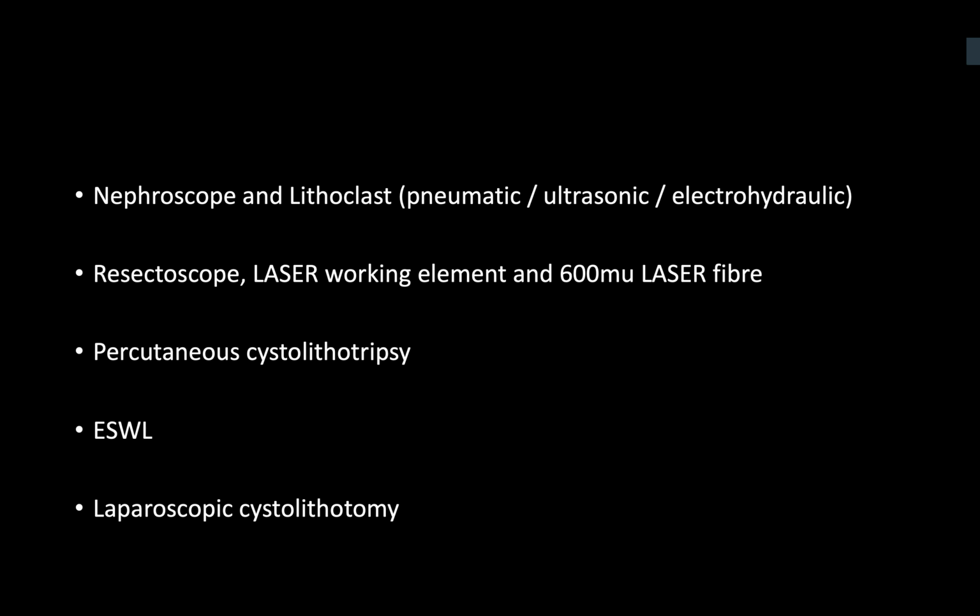Yeah. And there are options like percutaneous cystolithotripsy, where we can use the suprapubic tract and a sheath and then powder the stone, or we can use open cystolithotomy if we cannot remove the stones and none of these instruments are available. And there is literature on laparoscopic cystolithotomy as well. So that brings us to the end of the technology based on the stones.